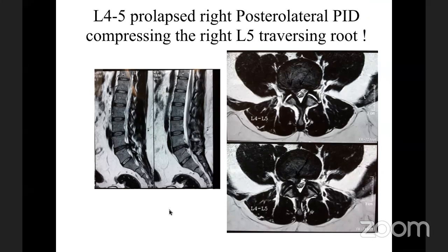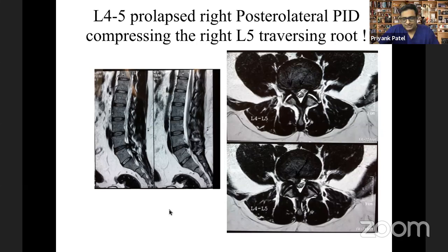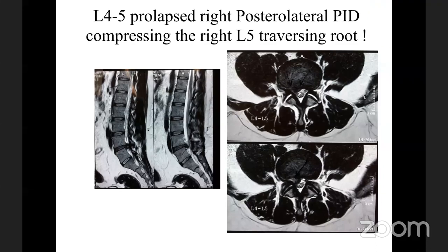Right. That was an important point that you made there. So the radiologist basically numbers them from the top. Yes. And we basically see our limited lumbar images, so we start counting from the bottom. But that's just tomato and tomato. It really does not make any major difference. Right. Please carry on.